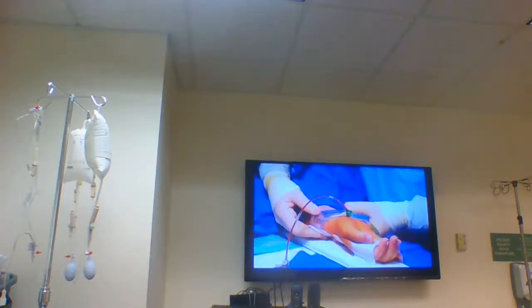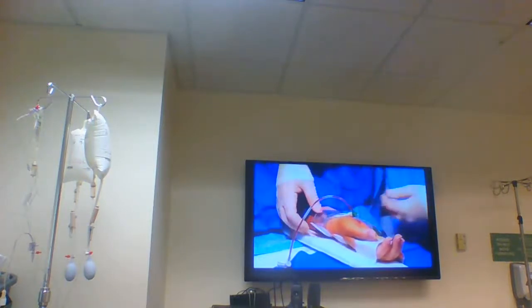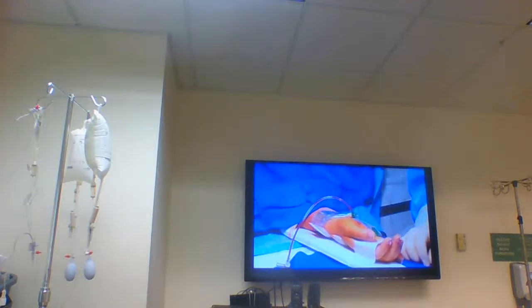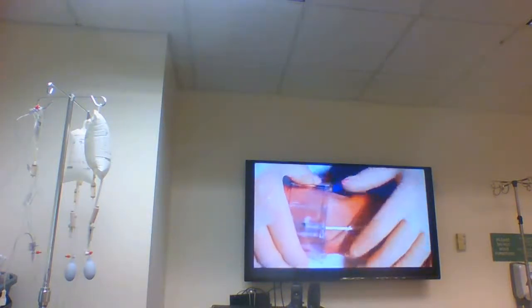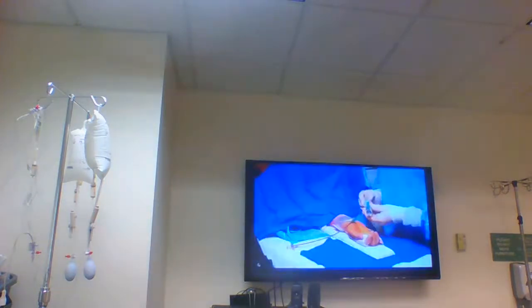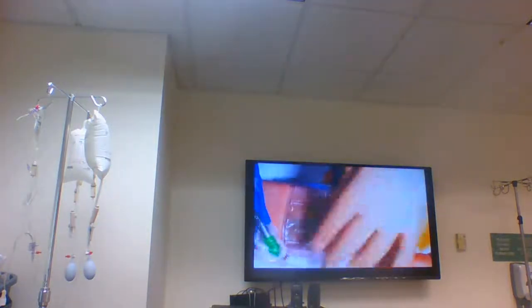Mira, you see that placement of the green dot on the bottom? The one that they brought me was smaller than that, but they brought it afterwards, like once she had a hematoma. They didn't bring the band like, you know, properly secured. I will fill the inflation syringe with 15, no, to me 18, lo trajo Lala, mLs of air. Lala, pero te digo, once again, no instruction más que, they will come at 3.